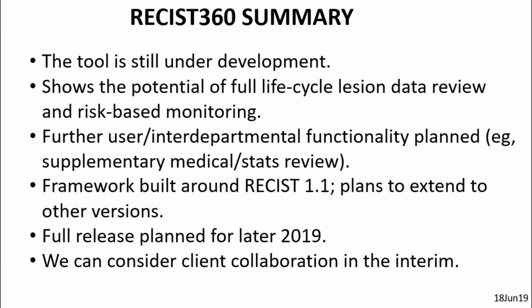The framework of this tool has been built around RECIST 1.1, but we do have plans to extend to other versions of RECIST. The first version is planned for release later in 2019, but we can already consider client collaboration in the interim.